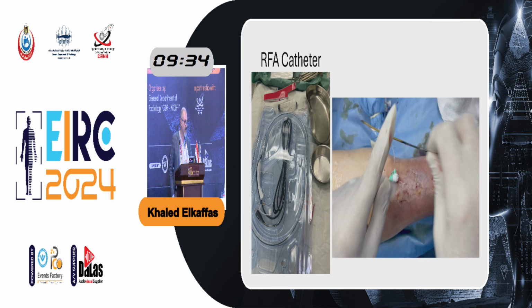Now we'll go to different modalities. The first modality I'm going to talk about is radiofrequency ablation. Here is the appearance of the radiofrequency catheter. The most common one we use is made by Medtronic, an American company. You can see here that the catheter has a long heating element. This heating element is about 7 centimeters in length, so it's a segmental ablation of the vein. We ablate 7 centimeters by 7 centimeters in this procedure.